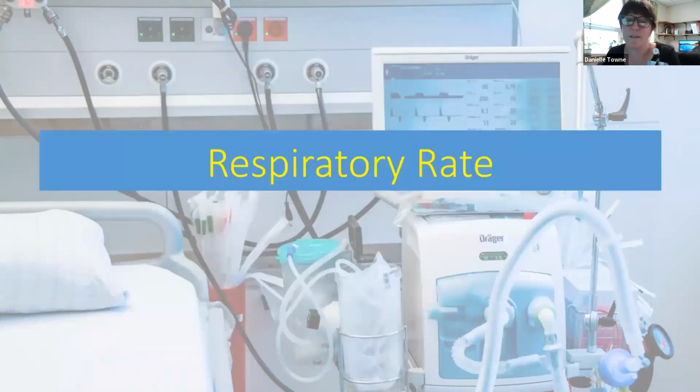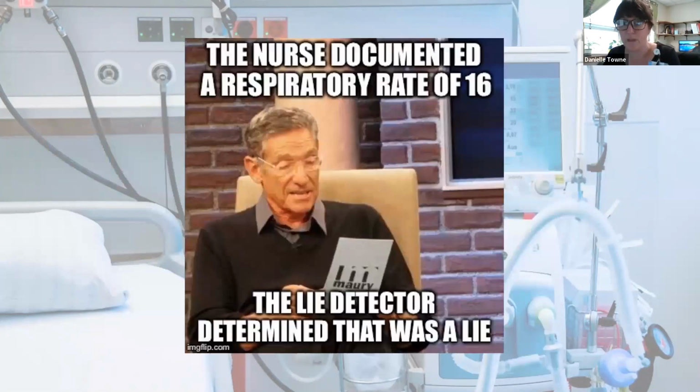Okay, we're going to need to set a respiratory rate on our vent. The respiratory rate equals the number of breaths within 1 minute. Now, normal ranges are between 12 and 18, but severely acidotic patients might require respiratory rates of 20 to 30 or even higher to blow off the excess CO2 accumulating in the body. So here's an example of when you might see that.